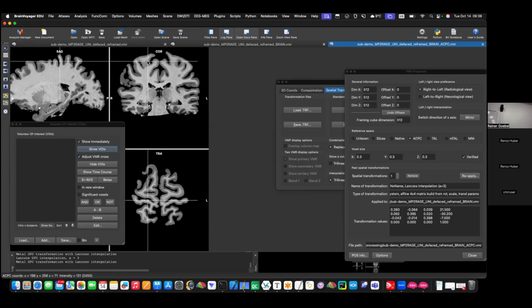So if I do file, okay, now if you close, yes, and there are some of the files. Yes, perfect. This is the one we want, the one we look at later. Actually, just open it, it does all the steps for you. I think you forgot to say 512, because now it's in a very small box. I'll show you how to correct this.